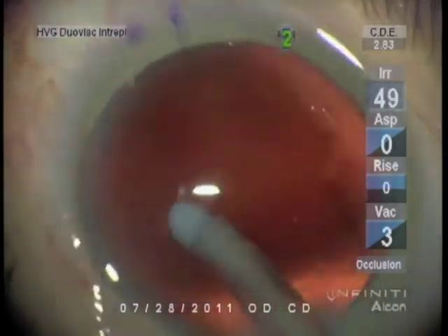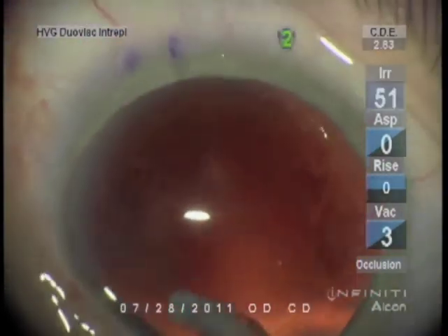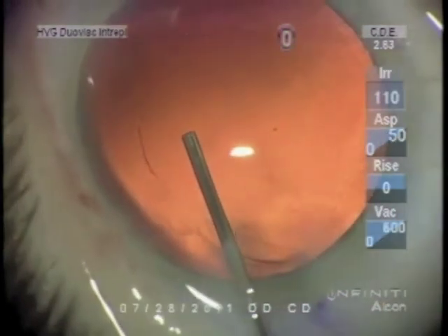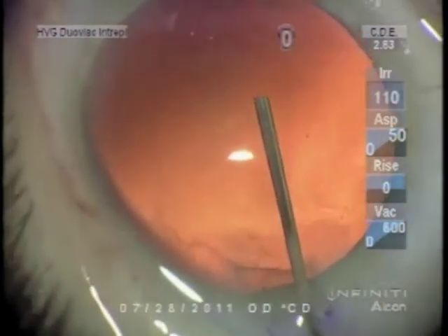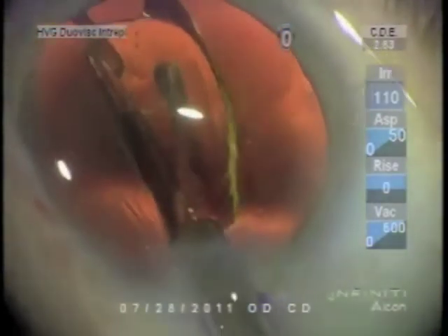If you are out that far, use practically no vacuum — like two millimeters of mercury. For polishing, a vacuum maximum of three millimeters of mercury. This is a cohesive viscoelastic for intraocular lens insertion, using a 2.2 millimeter incision.